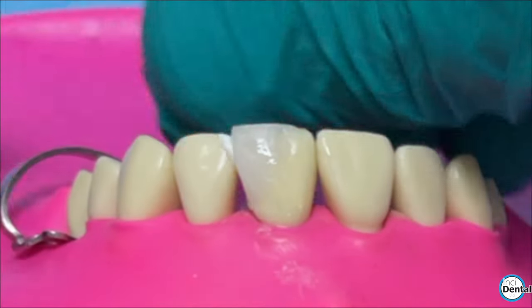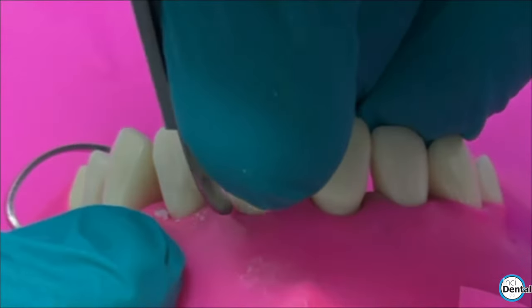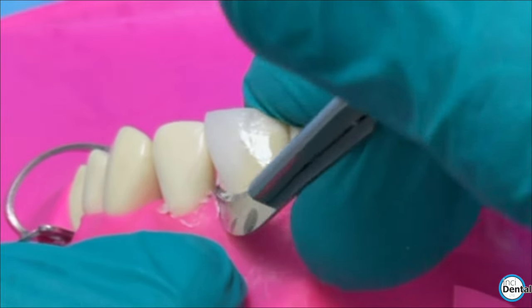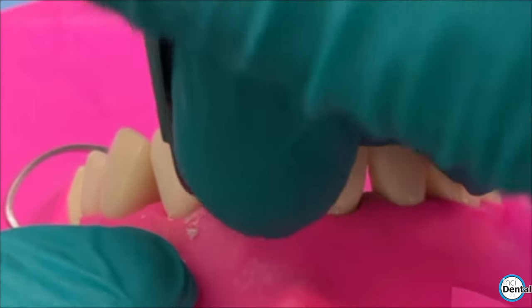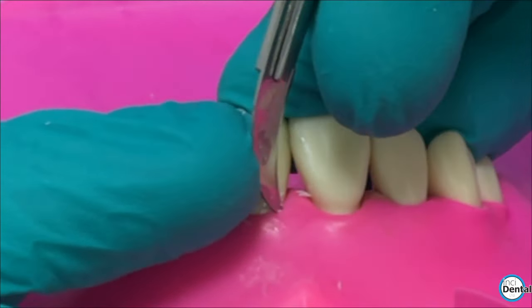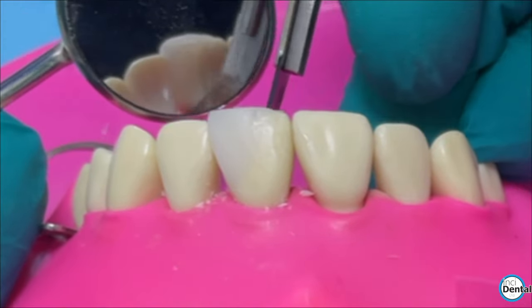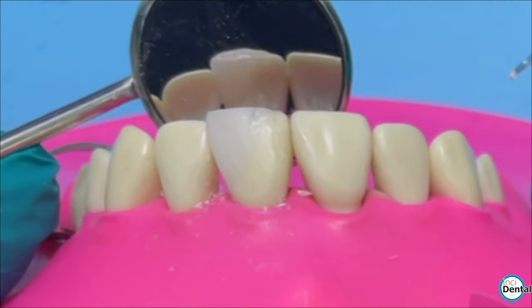We're going to take the wedge out, remove the PTFE tape, and clear it up a little. There are several instruments you could use to clean up the flash and excess composite, but what we prefer for anterior restorations is the 12 blade in a rounded scalpel holder — it gives good control, and we're going to be releasing one with a one handle coming soon. There's also the restorative sickle scaler, which is in the classic kit, and the curette, which is in the posterior kit. All do a similar job removing excess, but we favour the 12 blade for anteriors.